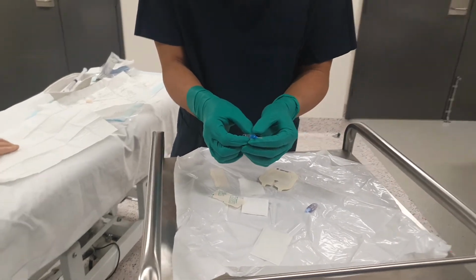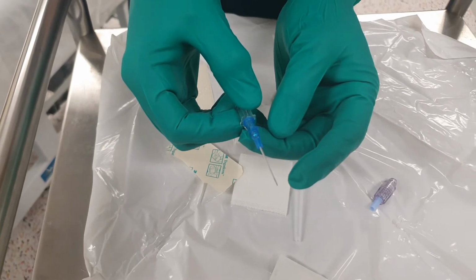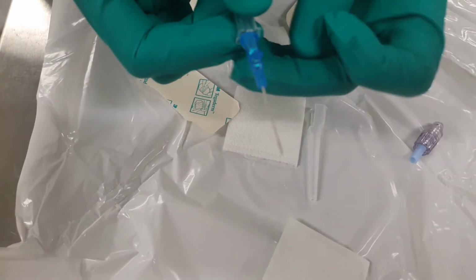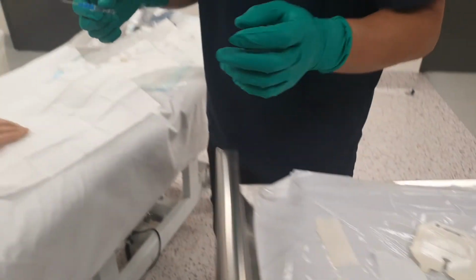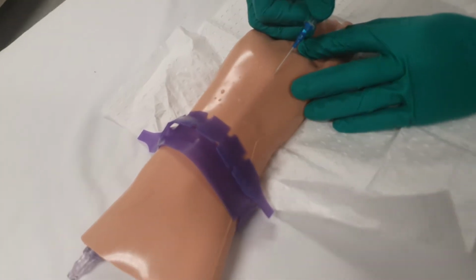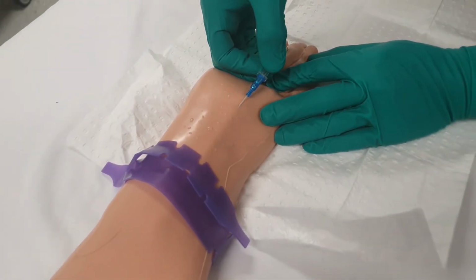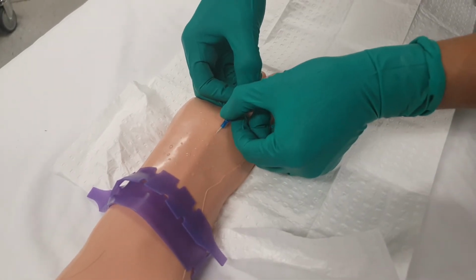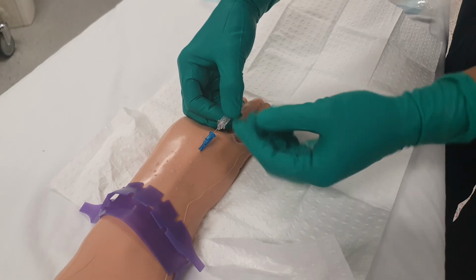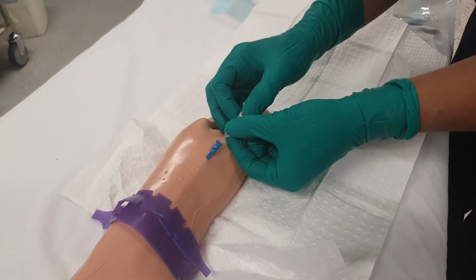Okay, so rotate the cannula so that the bevel, which is that little hole there, is facing upwards. So when you pierce the vein, the blood's going to shoot up. All right. So keeping still for me, madam, or sir, I'm going to go in with my cannula. I'll feel a little bit of a pop. Okay. Get some flashback. Now, a lot of the time there'll be blood coming out of this. I think that this is an empty cannula.